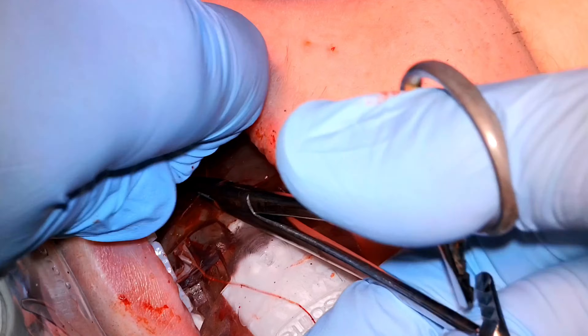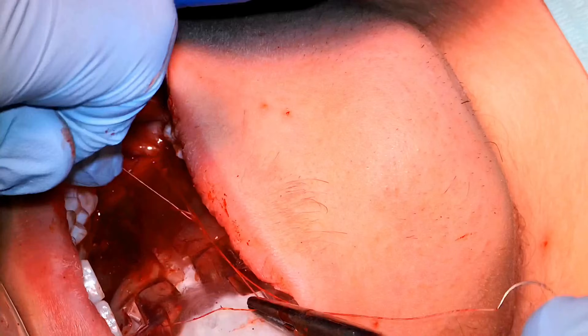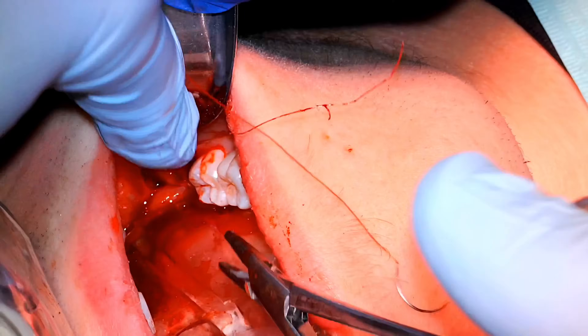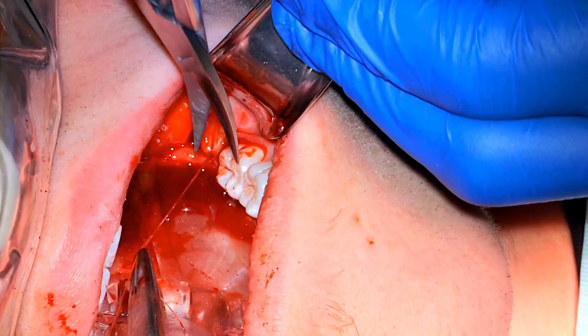I'm doing some throws and sliding them down — using my middle finger to reach further back in the mouth, which kind of allows me to get back there. That's always the challenge: reaching in far enough. I've transferred both to my left hand and the needle driver. Looking at the tooth after sectioning — that imperfect split could have been prevented by aiming a little bit more mesial to the buccal groove. That would have been a better section. There's the purchase point.